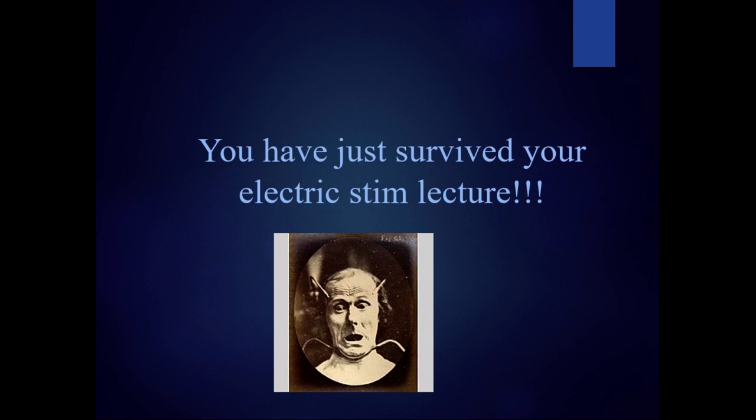Is it something they're going to be able to do on a regular basis? In the clinic, is it something you're going to have enough time to do in the session time that you have? Can it be used by the patient at home, like a portable TENS unit? So you want to take that into account: cost, convenience, and availability. You don't want to do a treatment that the patient's not going to have access to.